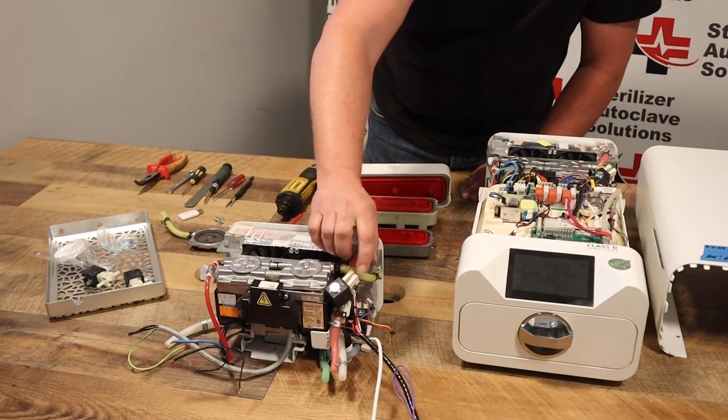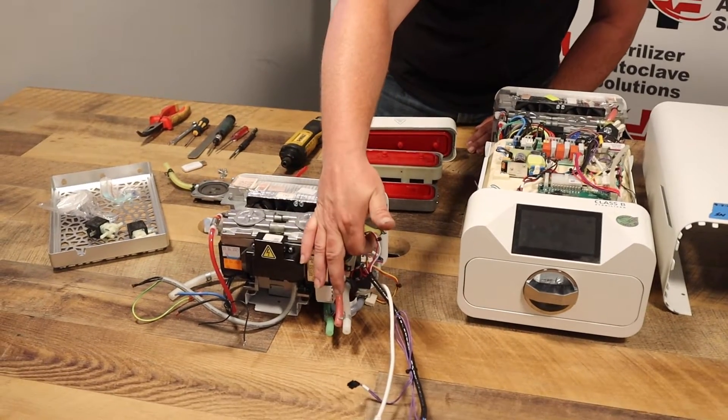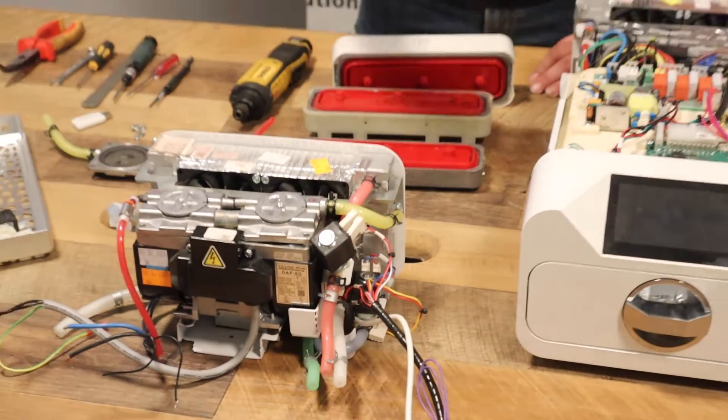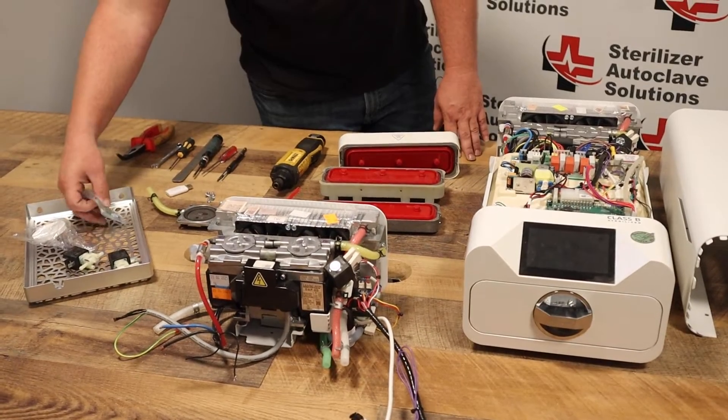When hooking these connections back up, you need to make sure that valve two is hooked and valve five is hooked in the proper direction. If you reverse them, you will have issues.